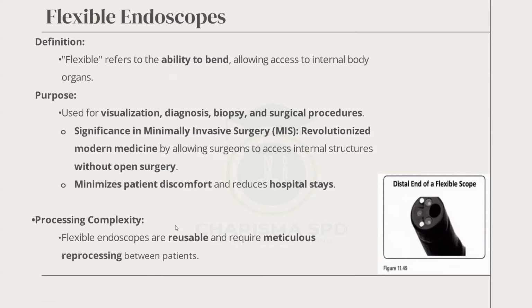Now, fiber optic endoscopes. They can be bent. Ability to bend, we saw that. They are used for diagnosis, for visual, for biopsy. Maybe for emphasis, that's why they are repeating, giving you additional information. They're used for minimally invasive surgery. The acronym for minimally invasive surgery is MIS. If you hear MIS, it means minimally invasive. Small hole, enter, do the work, get out.